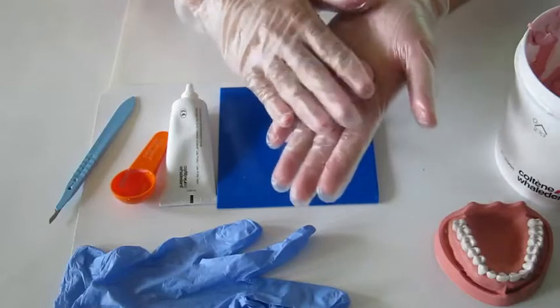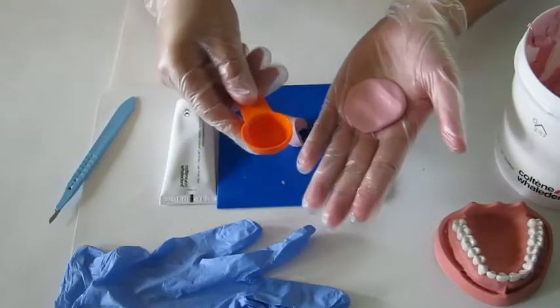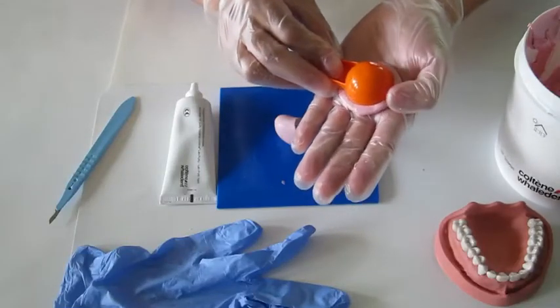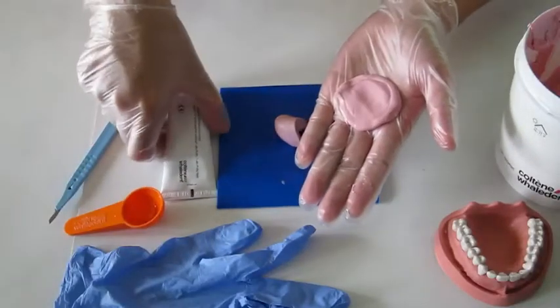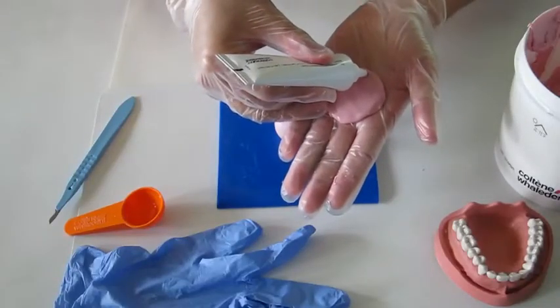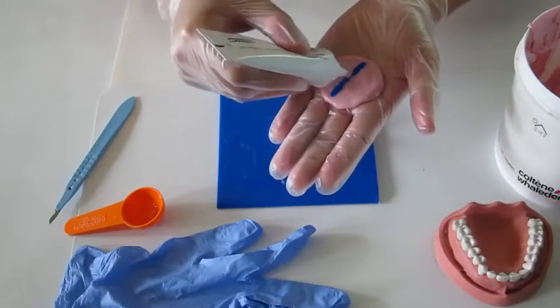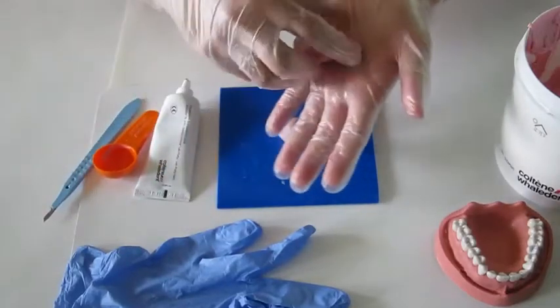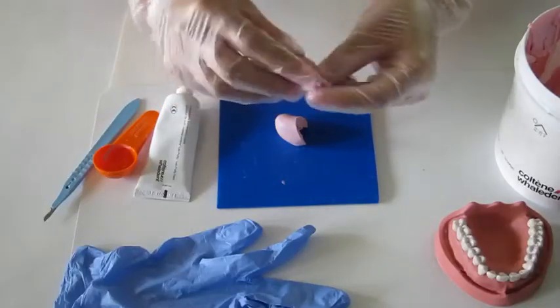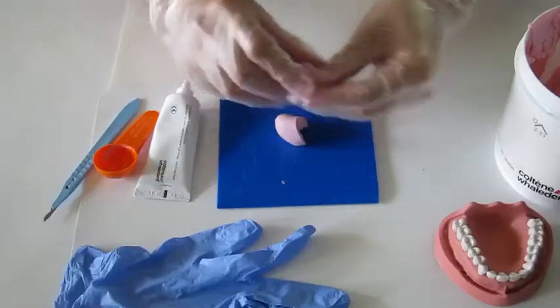Spread the base on the palm of your hand. For each scoop of base, press the scoop ring into the mass. Use one strand length of activator per circle diameter. Then fold the material and knead with your fingertips for 30 to 45 seconds until a homogenous, pink-colored mixture is produced. Do it quickly.